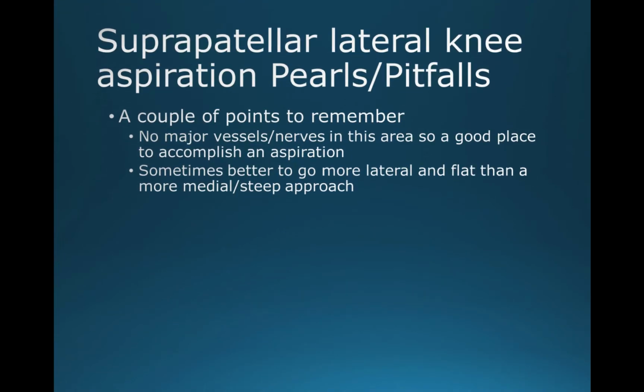Some pearls and pitfalls just to remember. There's no major vessels or nerves in this area in the suprapatellar lateral knee approach. This is one of the reasons why I prefer this approach. Also, sometimes what I will do is I will go a little bit more lateral and flat more than a medial steeper approach. Coming a little bit more laterally and flatter, you get a better angle of attack.